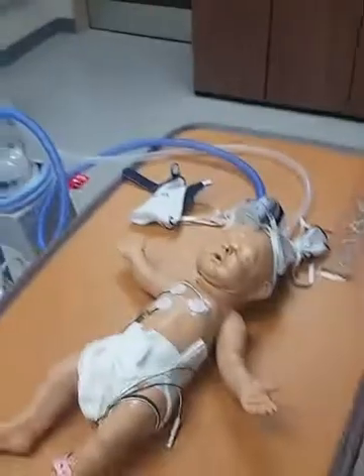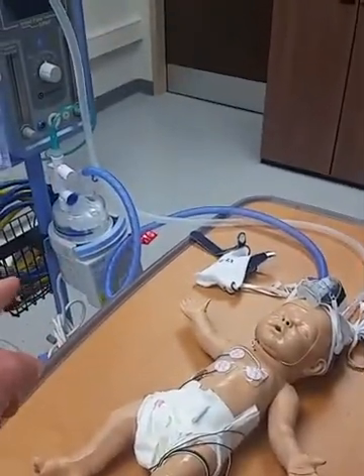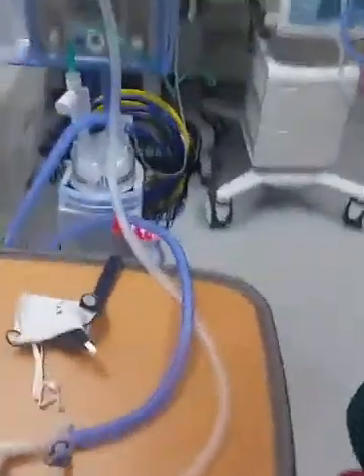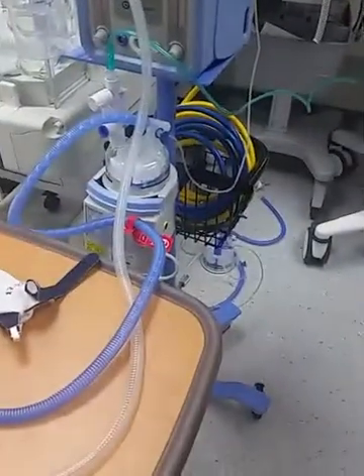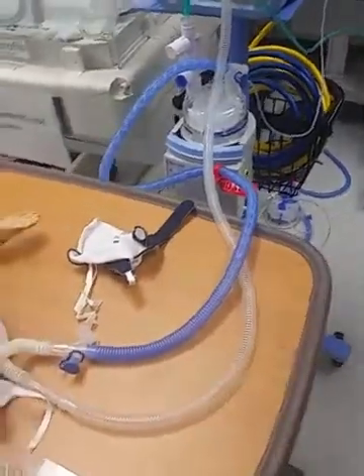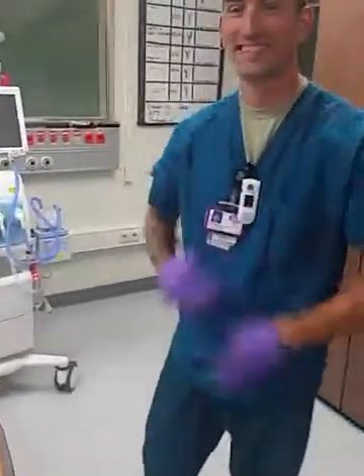And then when you set up the circuit, you would just make sure that the heater is on, full of sterile water, and has the cables plugged in. Alright, that's it. Good job.